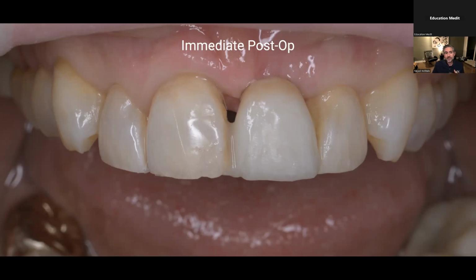And in this case, I had talked to the patient. The Pontic for the Essex was a little bit darker, but she said totally fine. I asked her, would you rather have lighter or darker? And comes as no surprise, she said, I'd rather have lighter. And I checked up on her after delivering this. She said, it's perfect. These teeth are dehydrated right now, but she's very happy with this.